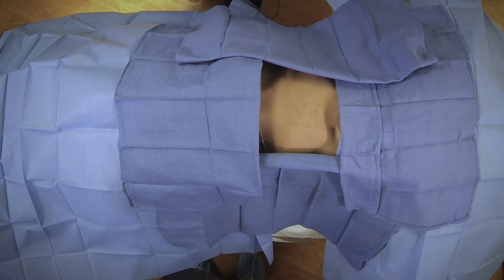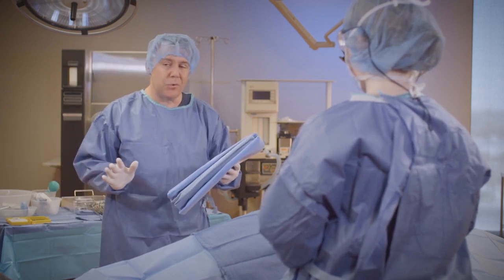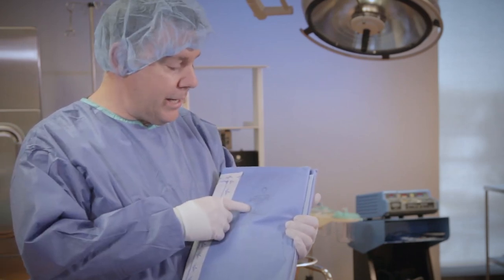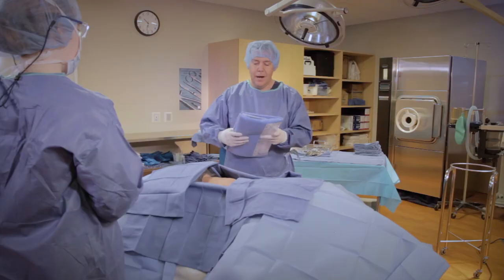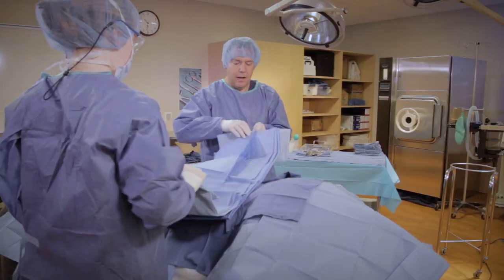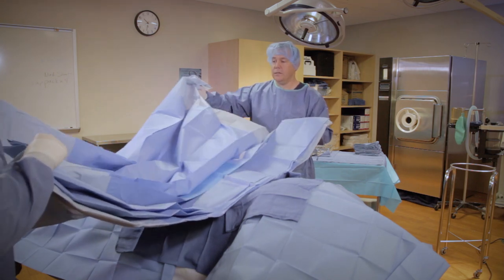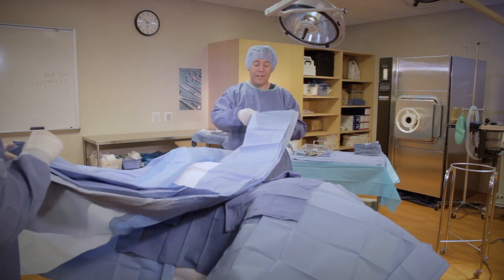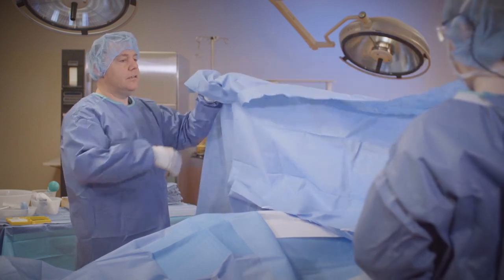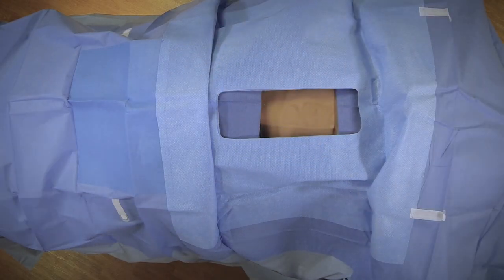We have a pretty good squaring off right there. Our last drape is the laparotomy drape. The great thing about drape manufacturers is they tell us exactly how to put this drape on the patient, so we can see our little man here telling us which way it goes. I am going to place this right at the incision site, we are going to unfold it, the surgeon is going to grab one side and I am going to grab the other. We are going to cover our hands and extend, completely unfold the drape, cover our hands again and extend. Our surgeon is going to grab the white paper and there we have it — a complete and perfect patient draping for supine or prone position.